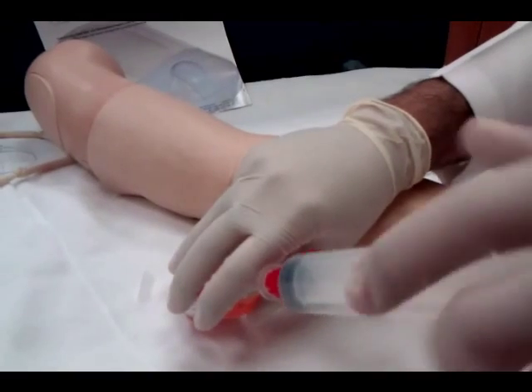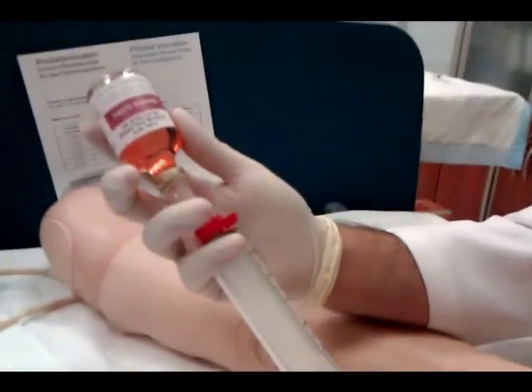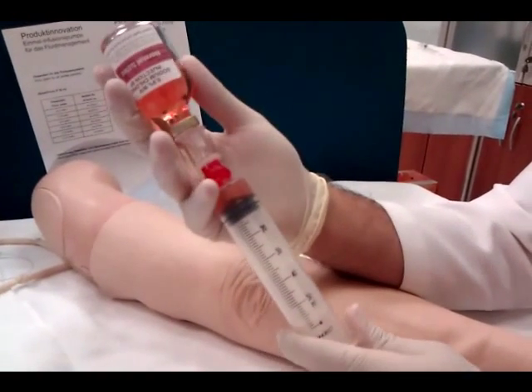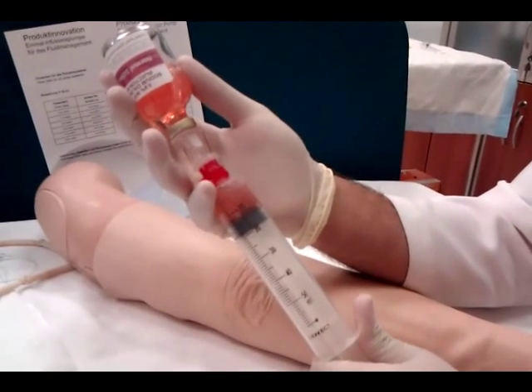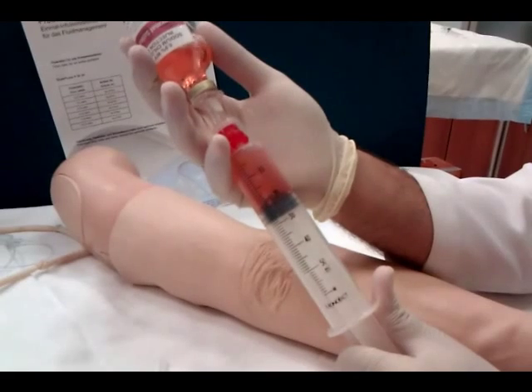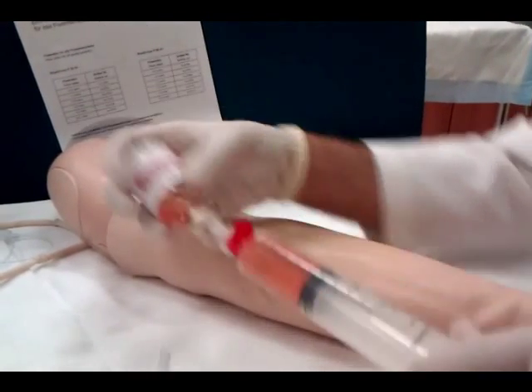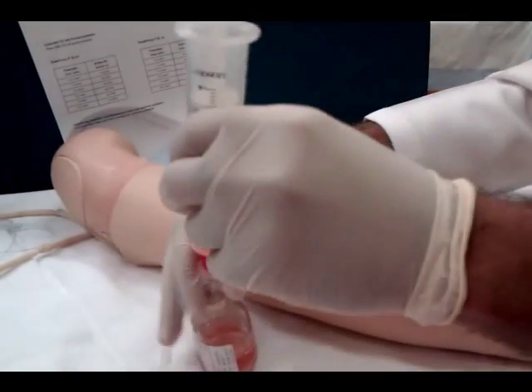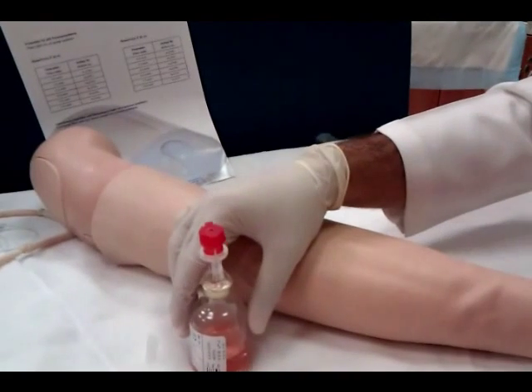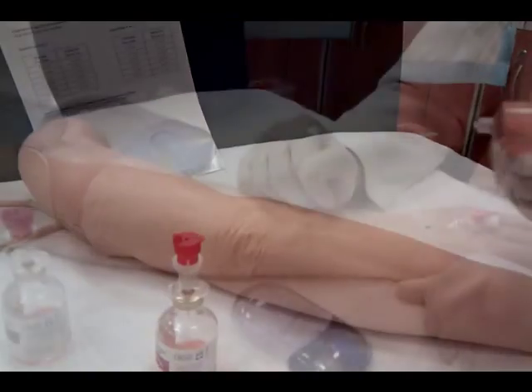You use the Luer lock syringe and then you draw the medication. It's very simple and very important for infection control related to the medication. Let's say this amount of medication, we fill it, and then we take out the syringe, and you can keep the special connector to prevent any problem to the rubber or any abrasion.